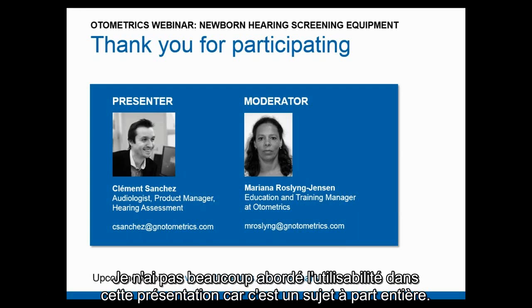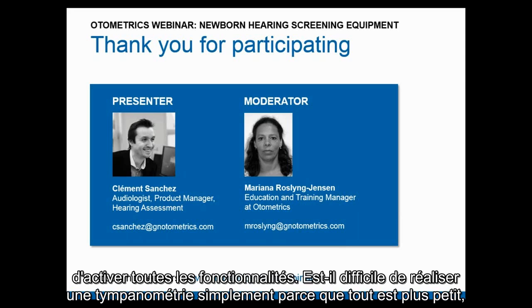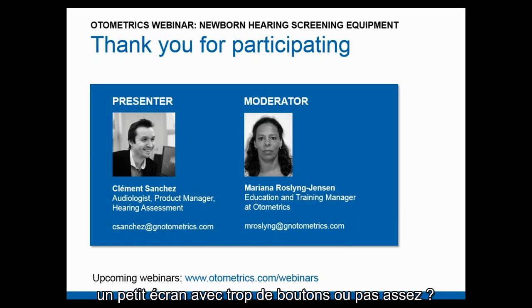I didn't talk too much about usability through this presentation because it's a huge topic, but usability or ease of use is how easy it is to read the display, how easy it is to store the data into a computer afterwards, how easy it is to handle the different functionalities. Is it difficult just to make a tympanometry because everything is smaller, with a small screen and not too many buttons? That's something you definitely need to consider.